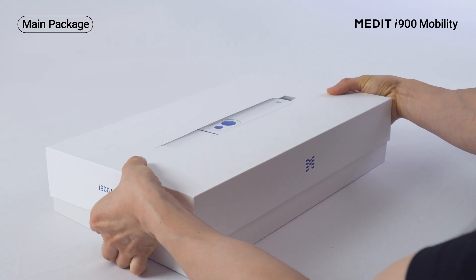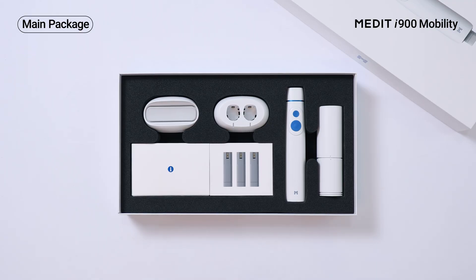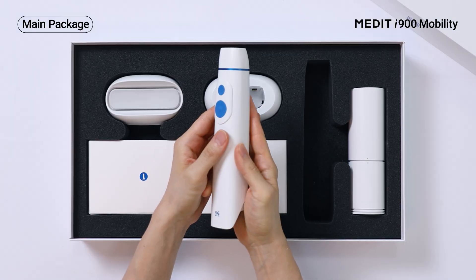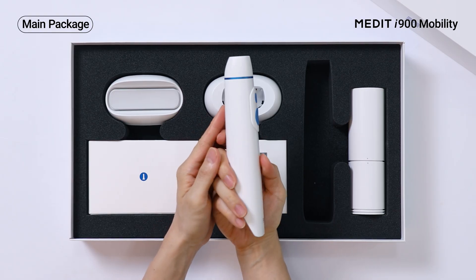Let's start with the main package. First up is the scanner handpiece. Check out a simple yet solid design with a comfortable grip.